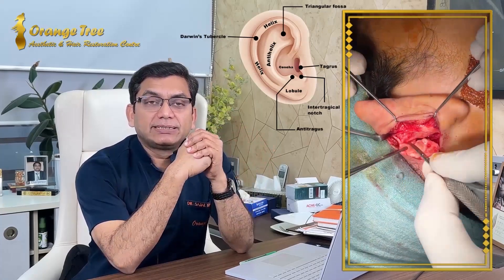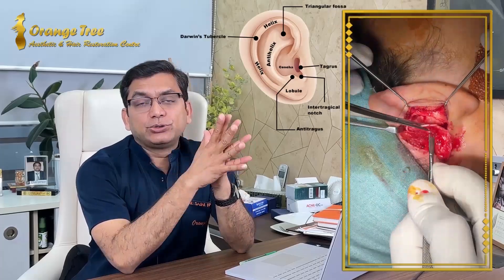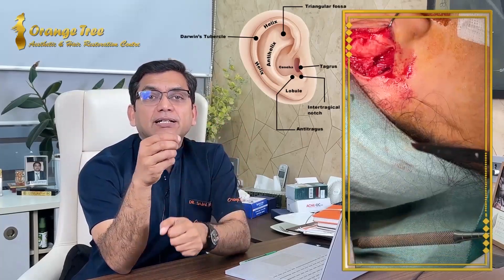Once this piece of cartilage has been harvested, we ensure hemostasis is achieved. Small bleeders are cauterized, and I don't place a drain. I take subcutaneous stitches along with the posterior sulcus base tissue so that the dead space is obliterated. Then I place a running continuous suture on the skin with 6-0 Prolene and pack the posterior sulcus with loose gauze, also packing the ear with loose gauze and cotton.